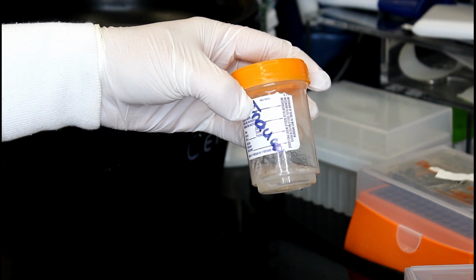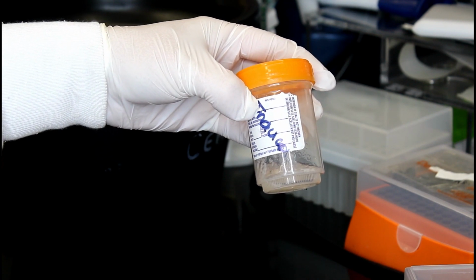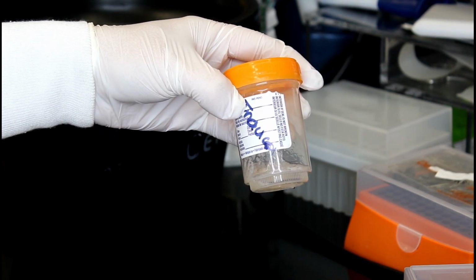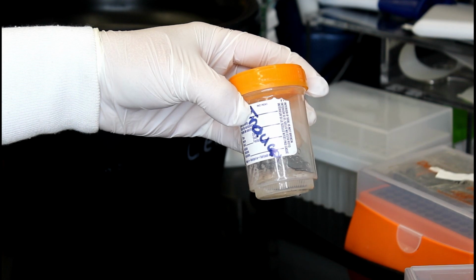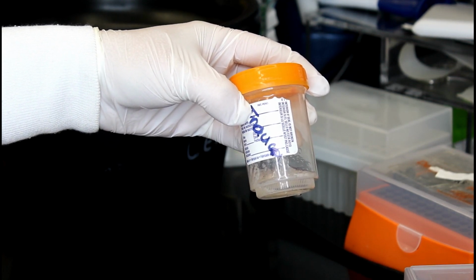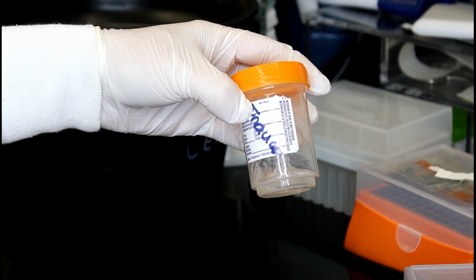Condition 3, you have less than a half a gram of induced sample. Condition 4, you have less than a half a gram of the induced sample and there is spontaneous sample. Condition 5, you have no induced sample but there is a spontaneous sample. If you have condition 5, there are 3 subconditions to that. Condition A, you have greater than 1 gram of spontaneous sample. Condition B, between a half a gram and a gram of spontaneous sample. And condition C, half a gram of spontaneous sample.